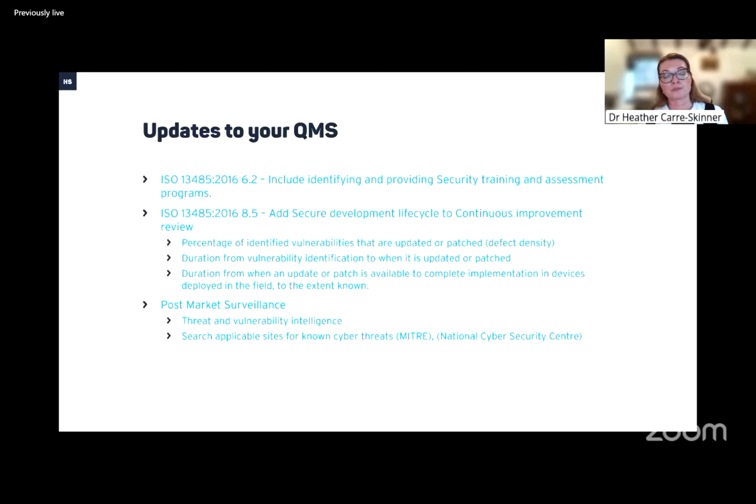Also, training is a big one to do. So as well as learning about 13485, etc., as a normal medical device manufacturer, also start learning about security and assessment programs as well. So for the UK, Cyber Essentials is a really good one as well.